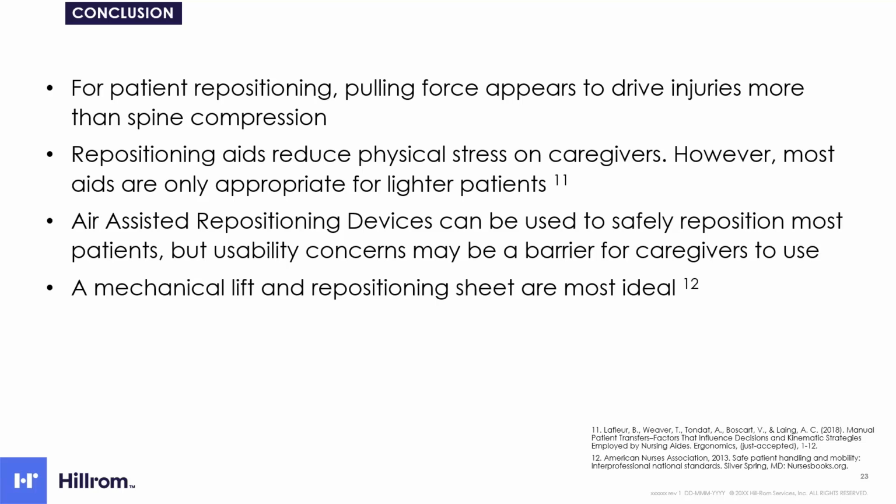Conclusion: for patient repositioning, pulling force appears to drive musculoskeletal injuries more than spine compression. Repositioning aids can reduce physical stresses on caregivers, but most aids are only appropriate for lighter patients, not for heavier patients. The AARD can be used to safely reposition most patients, but the usability concern may be a barrier for caregivers to use.